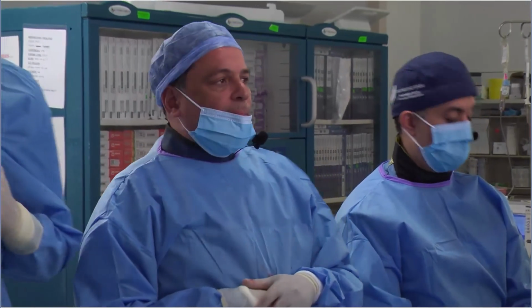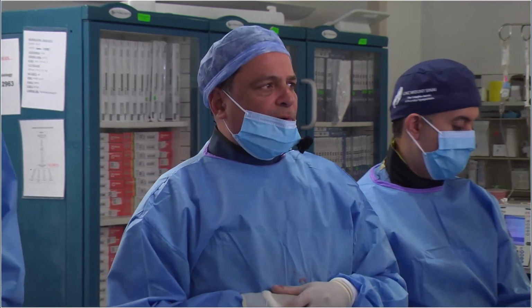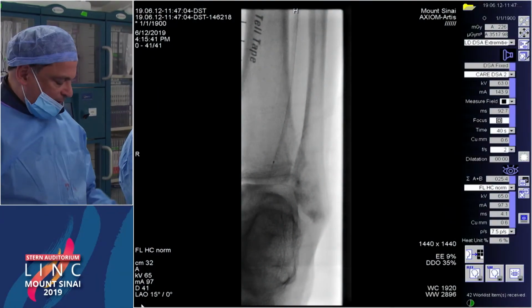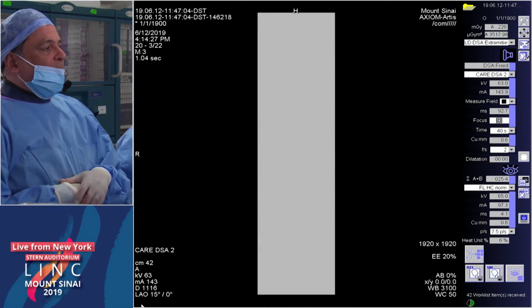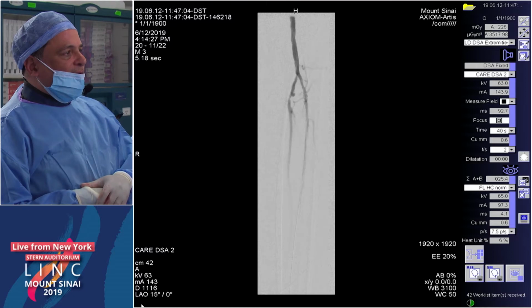Can we go back, Mike, to New York? Okay. Mike, I just want to show you, we got way ahead right now. She's having a little bit of pain because we're using a big balloon. I want to show you what we did there, sweetheart. So we did a quick balloon angioplasty, and now this is what we have.